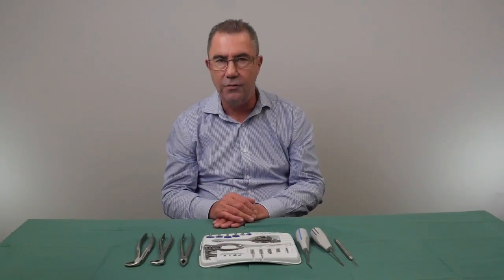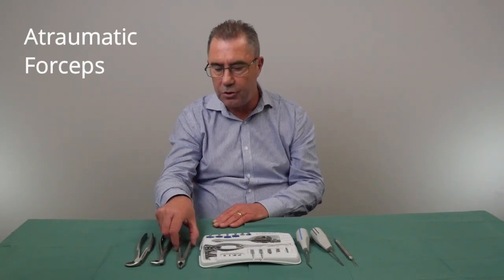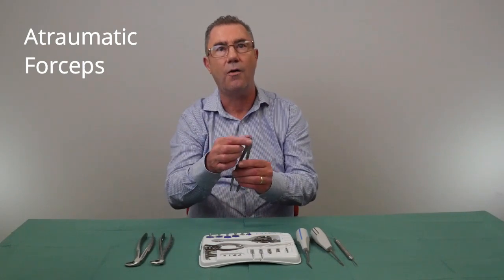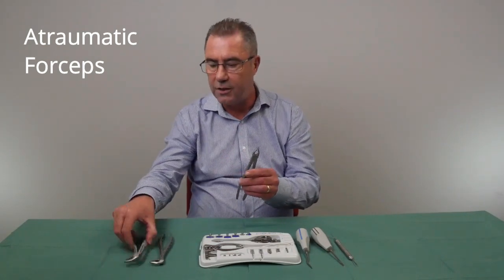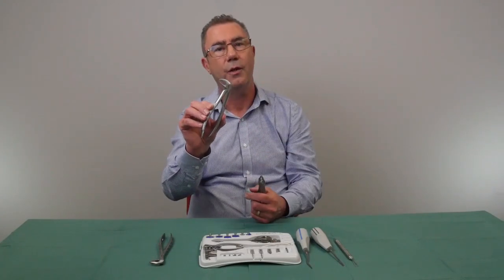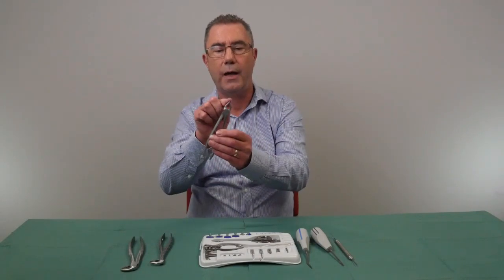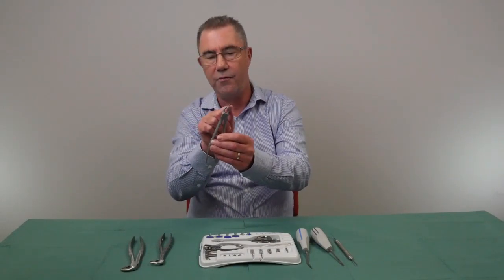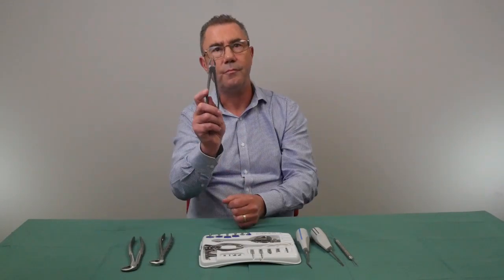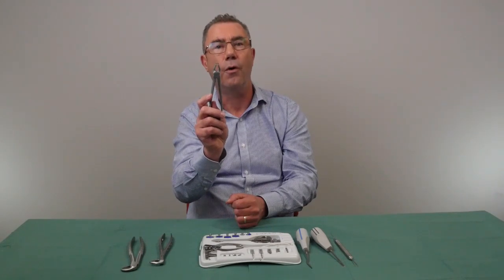The other important instruments are forceps. Some manufacturers produce what they call atraumatic forceps, which are finer than conventional types. You can notice how broad the blade is on a conventional forcep, whereas the atraumatic ones have much finer blades with more of a gap between them, making it easier to pass them up the length of the root and extract the tooth more atraumatically.